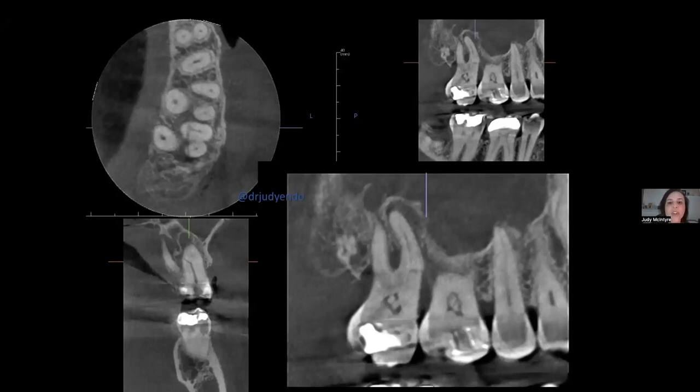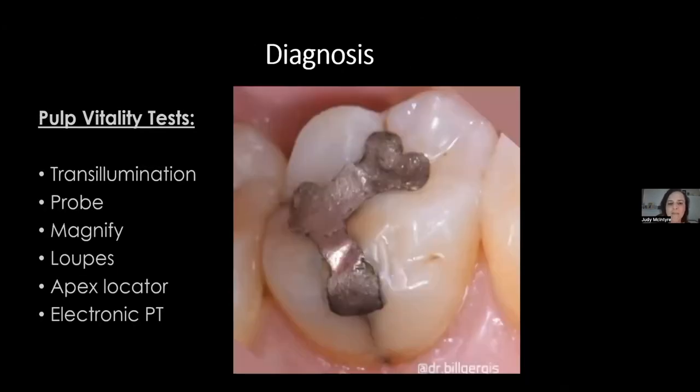All three of us know and can sleep well at night knowing that we've advised this patient with the utmost information. When patients come and I review their scans with them, they might not really understand what we're sharing with them on 2D. But when they see themselves in 3D, they really do take it home and understand what we're trying to convey to them, and they understand why this tooth can't be saved.